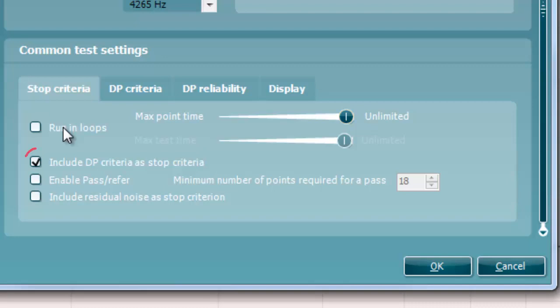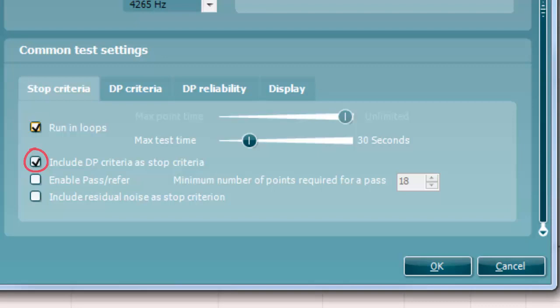Selecting Include DP criteria as stop criteria results in the system measuring a specific point for no longer than needed to meet the DP criteria as set out on the next tab.